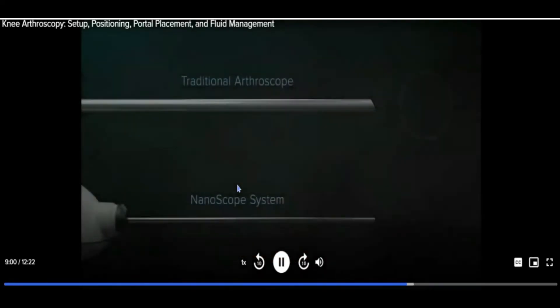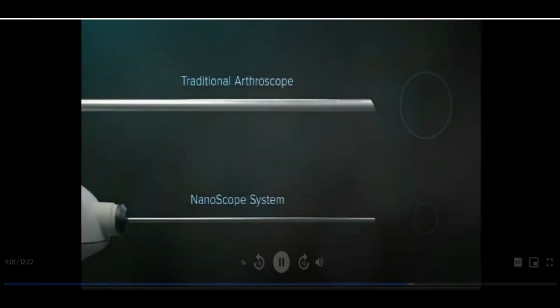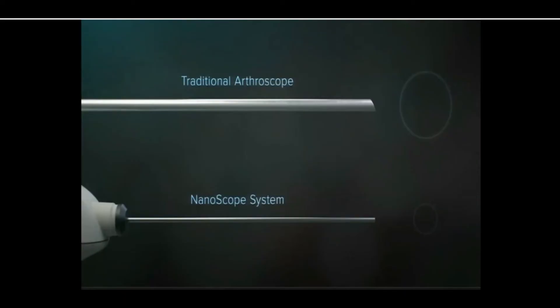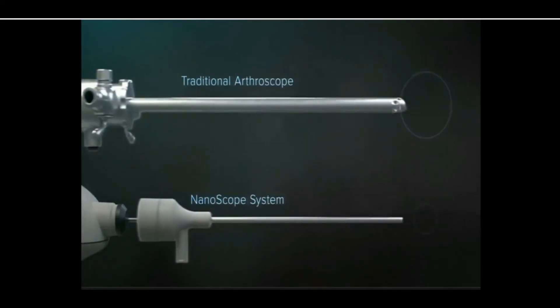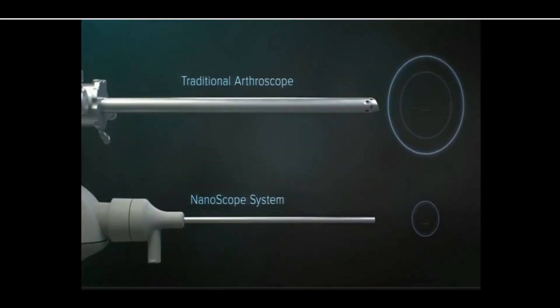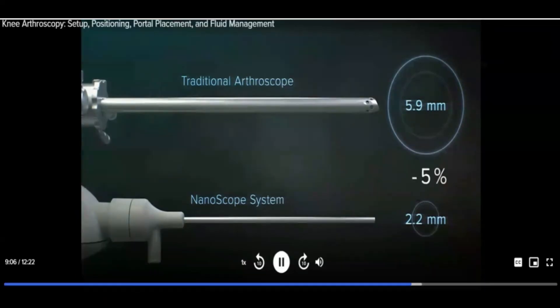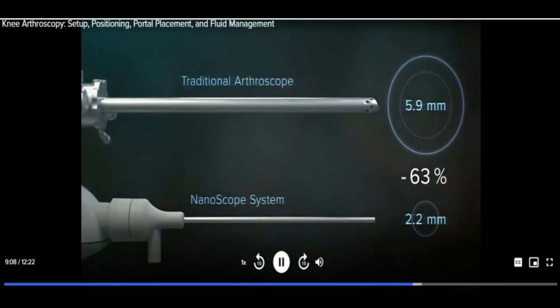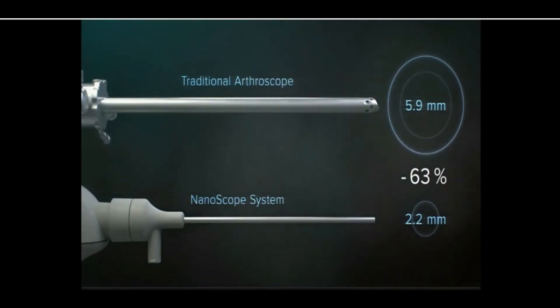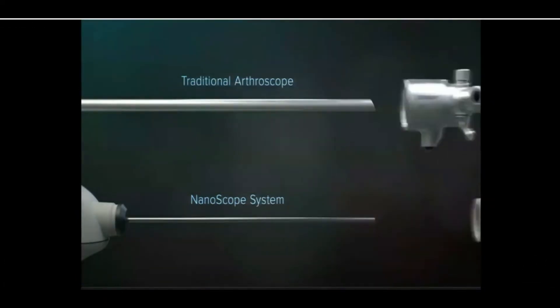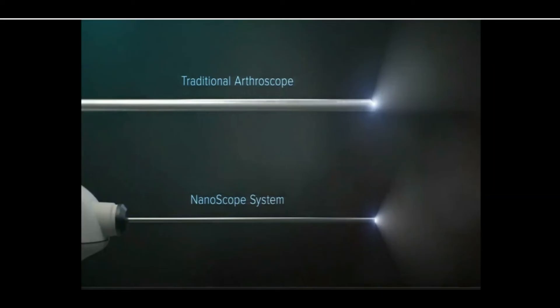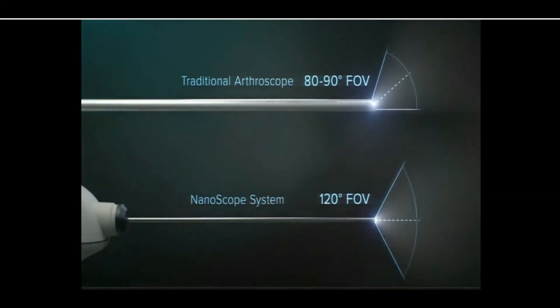The nanoscope system offers a zero-degree view with a greater than 50% smaller outer diameter, allowing for easy visualization of the meniscal roots even in the case of intact cruciate ligaments.